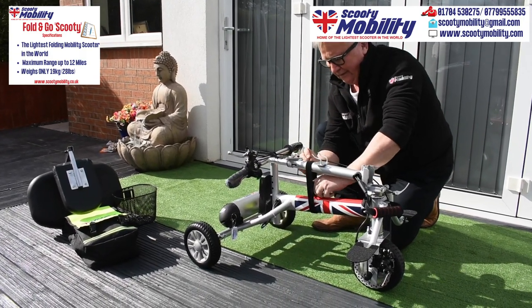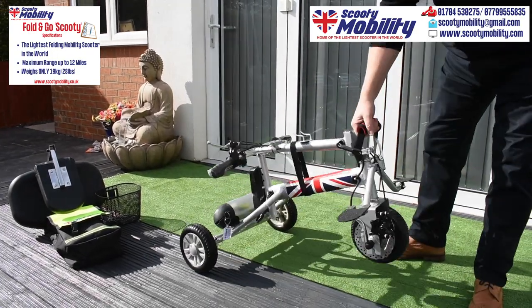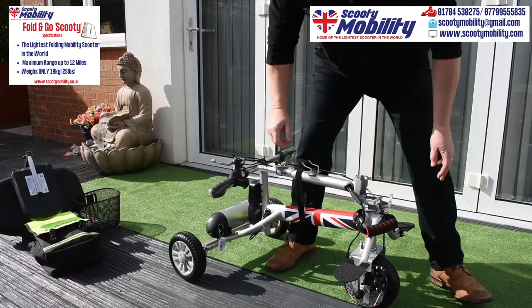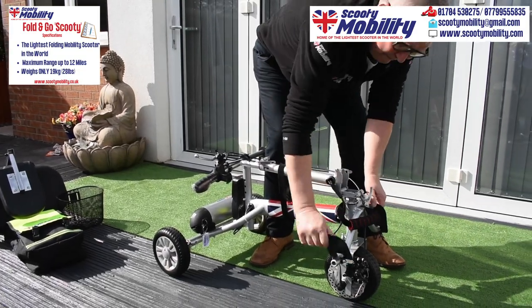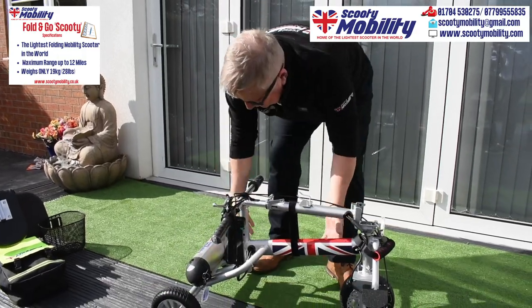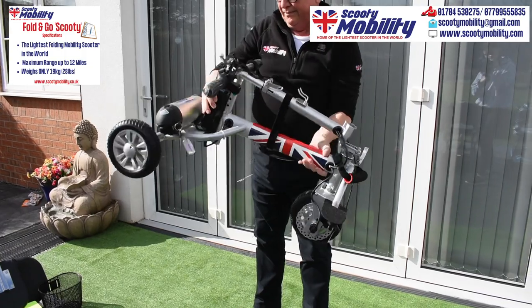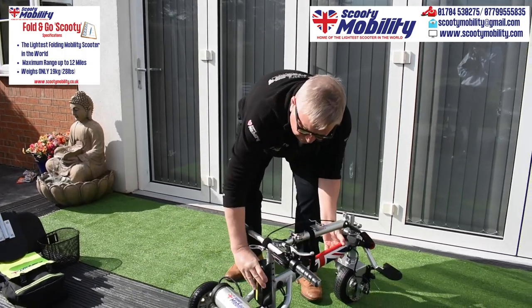Very easy to lift — I'll lift it here on the little handle on the front, just provided by the foot rests. Lifting it there with just one hand; two hands makes it even easier. It's a fantastic scooter, super lightweight. This is the battery pack.